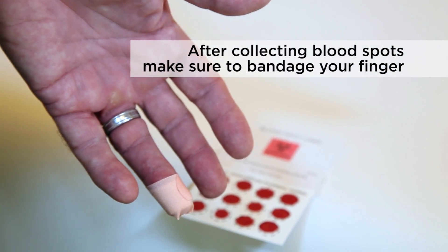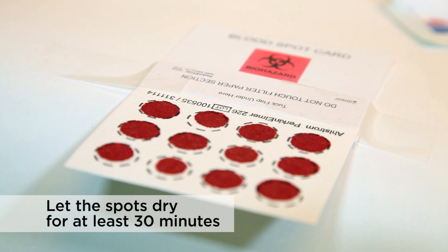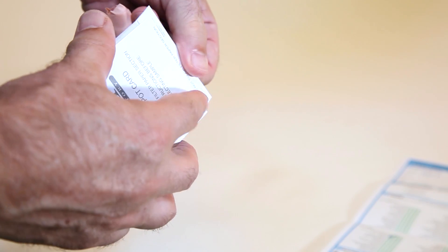Once you have collected the blood spots and bandaged your finger, let the spots dry for at least 30 minutes, preferably three hours to overnight, before closing the flap. Once dry, close the flap over the blood spots.